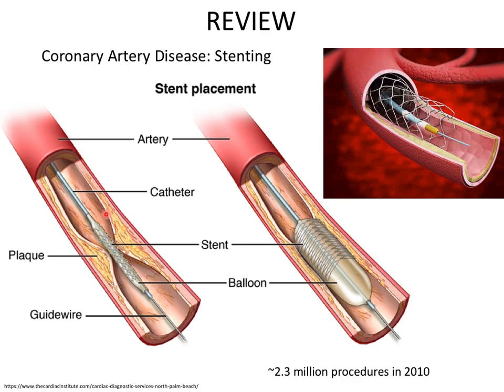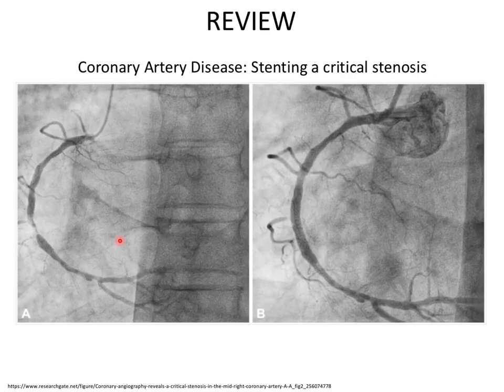If it's really tight, the contrast gets this far and stops, so you don't have a confident idea of which way to push the guide wire. That's basically a complete stenosis, and it is one of the hardest things to treat, especially if it's in a strange area.